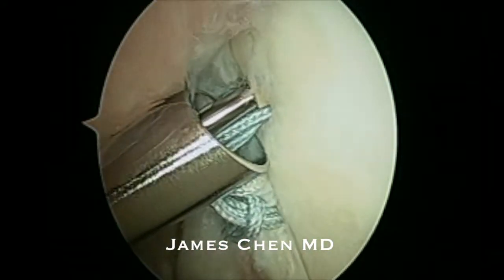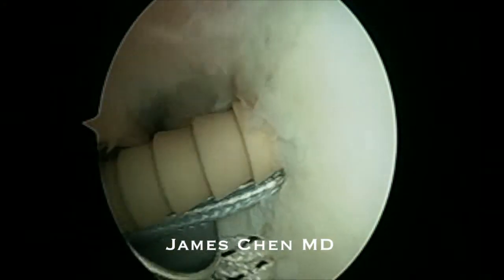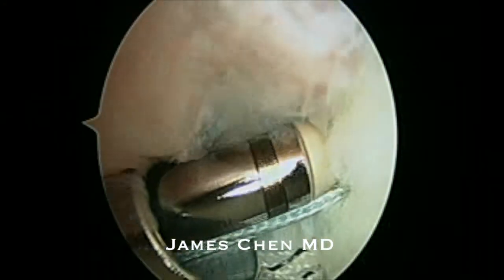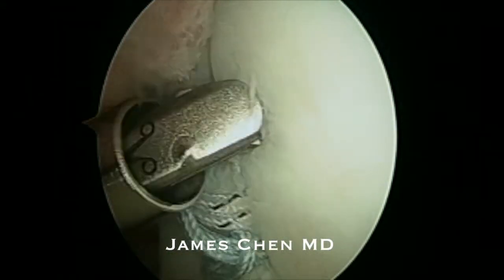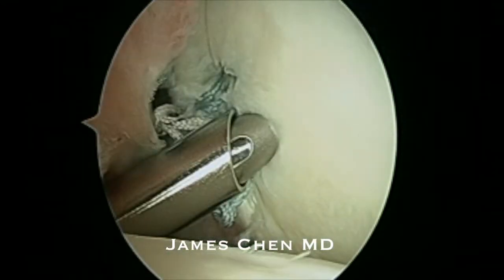I am then impacting a 2.9 push lock into the glenoid and reducing the posterior labrum. I then come with a micro cutter and cut the suture.